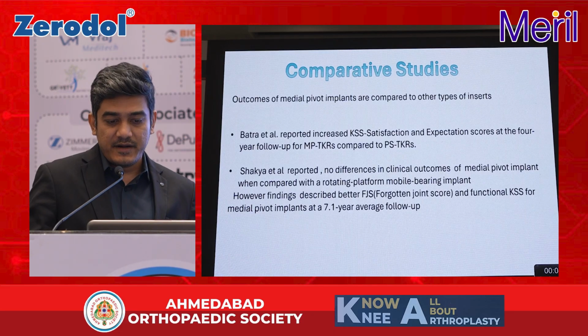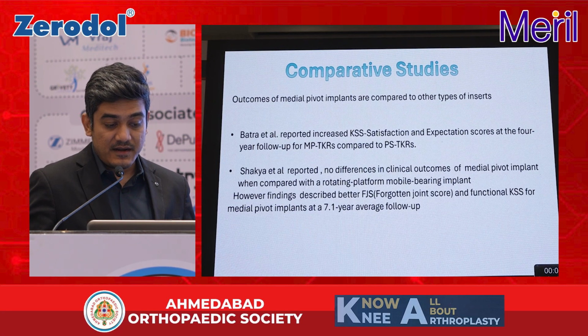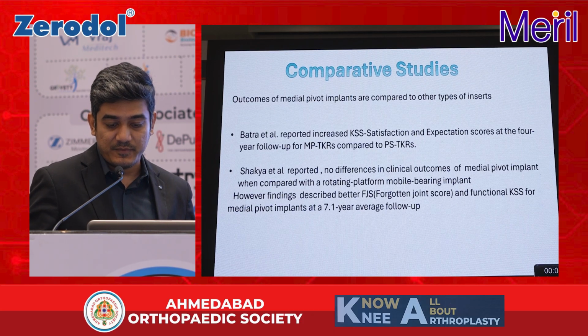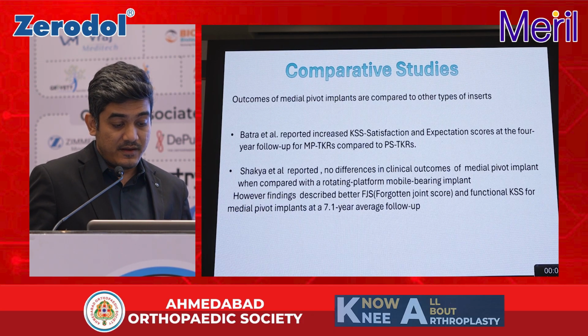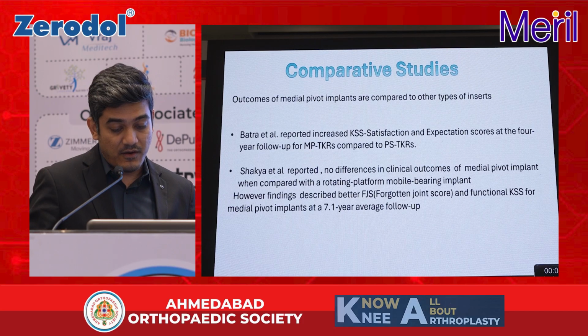There are also some comparative studies, where the outcome of the medial pivot implant is compared with other types of inserts. Batra et al. reported increased knee society score, satisfaction and expectation scores at 4 years of follow-up for the medial pivot design compared to the PS implants. And Shakya et al. reported no differences in clinical outcome of the medial pivot implant when compared to the rotating platform design. However, in this study, the findings described better forgotten joint score and functional knee society score of the medial pivot implants at a 7-year follow-up.